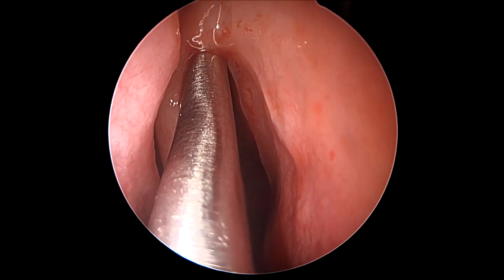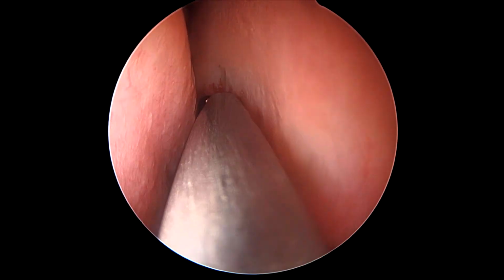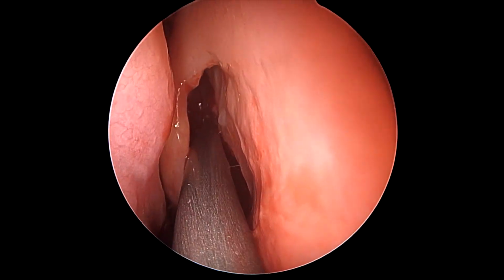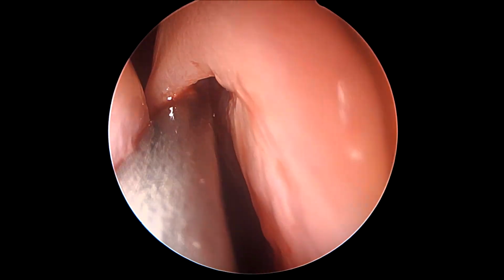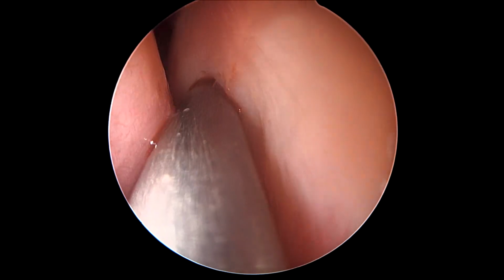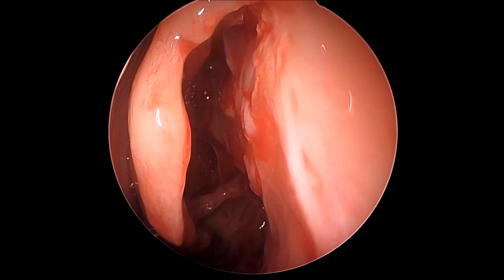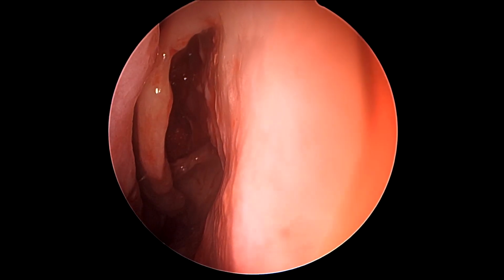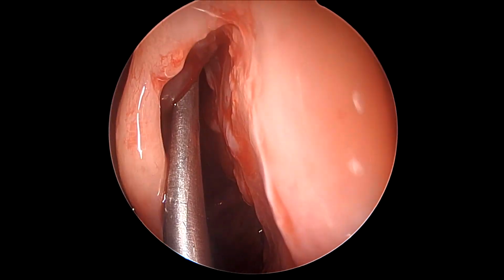And now to be able to conclusively see inside the frontal recess, as you see here, a curved instrument does go inside the recess, but not quite the sinus. And we have to increase the anterior exposure by removing the anterior wall of the agger nasi using a bone punch first, to be able to see more conclusively using a 0-degree endoscope. Till we do that, we are nearly in the blind, and we can work by the palpatory method, but not through inspection. So here we use a straight bone punch initially to remove some portion of the anterior wall of the agger nasi so that our vision inside the frontal recess becomes better with a 0-degree scope.